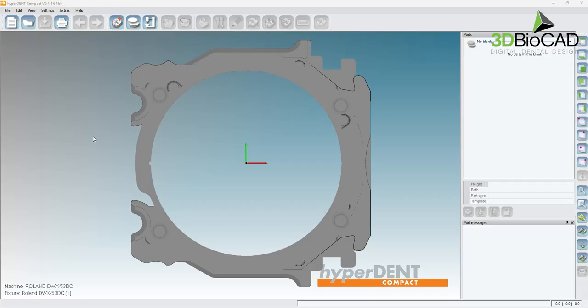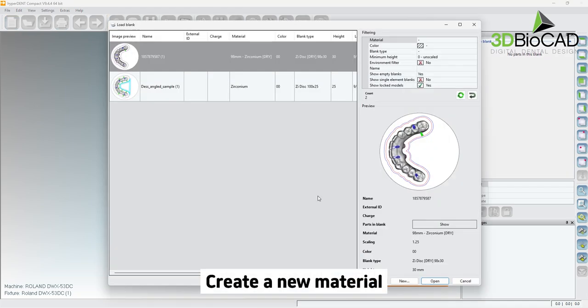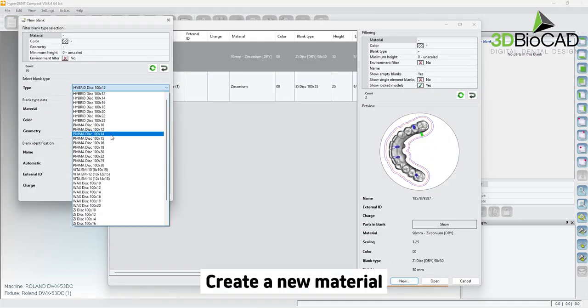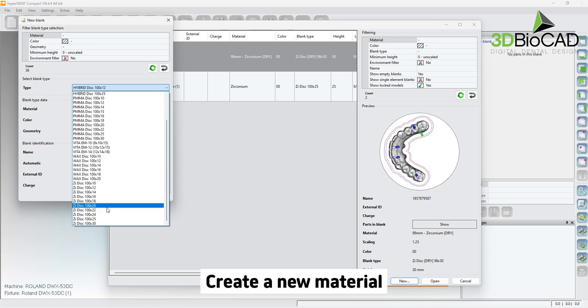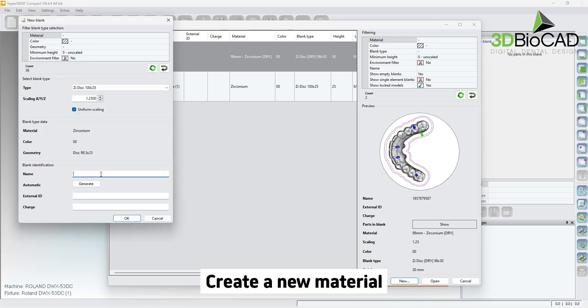Let's create a new material. First, click on the load blank button, then click on new. Select the blank type and size and name the blank, then click OK.